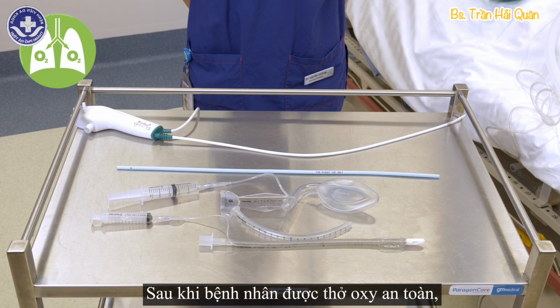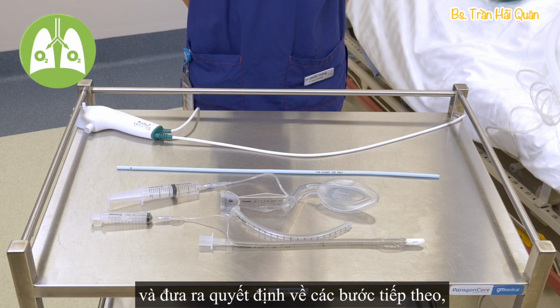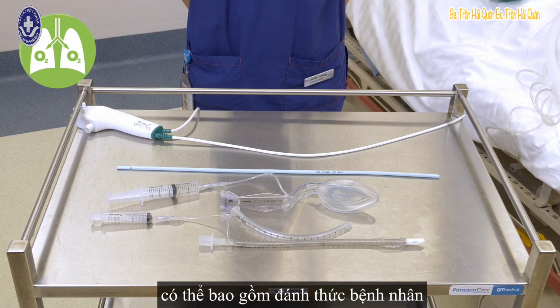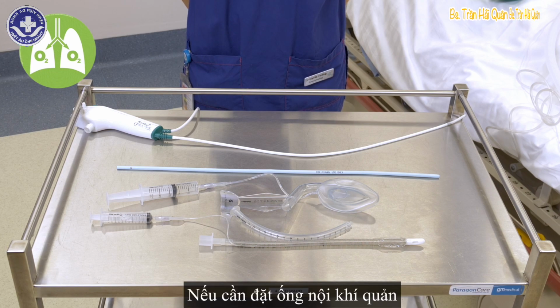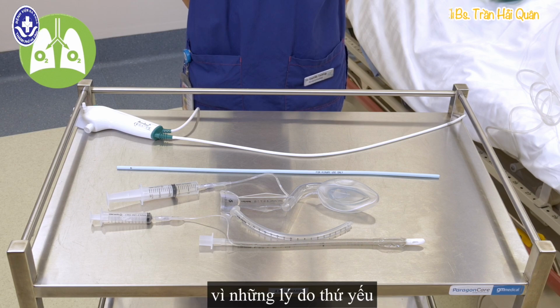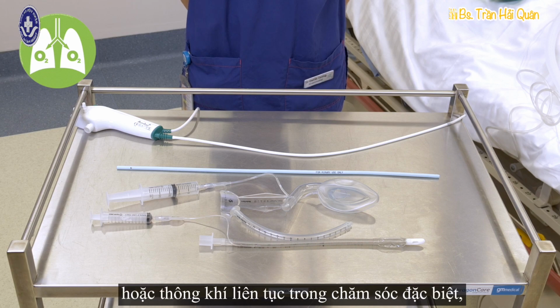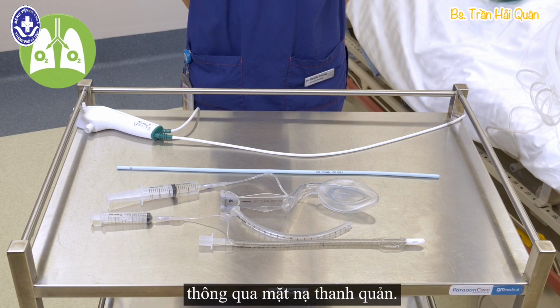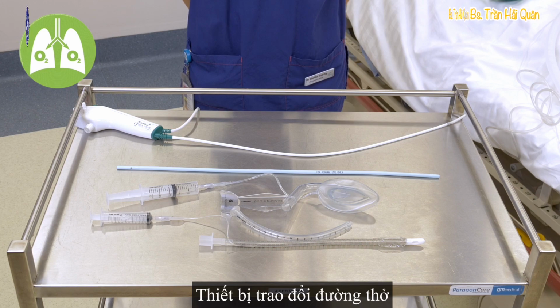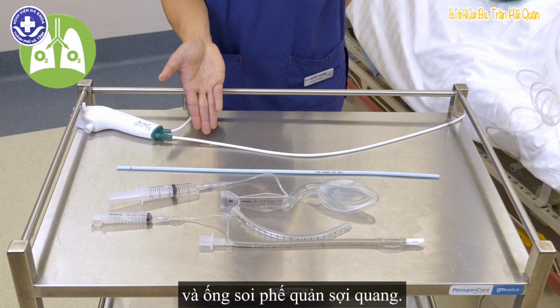Once the patient is safely oxygenated, there is time to think and make decisions about the next steps, which may include waking the patient or converting to a different airway. If an endotracheal tube is required for secondary reasons, such as protection from aspiration or ongoing ventilation in intensive care, there are advanced techniques that could be performed via a laryngeal mask. Equipment for airway exchange can include an Aintree catheter and fibre optic bronchoscope.